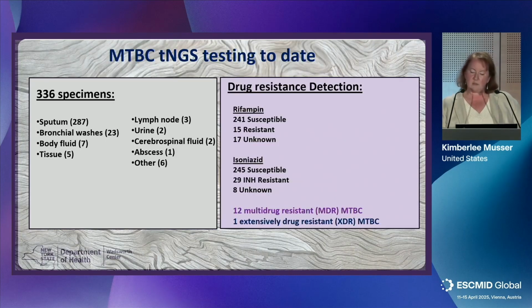And this is a little bit of our testing to date. You can see we've tested a number of different specimens since we brought this on. We've, of course, seen many pan-susceptible strains, but also some resistant, including 12 multi-drug resistant and 1 extensively drug resistant, which I'll tell you about.